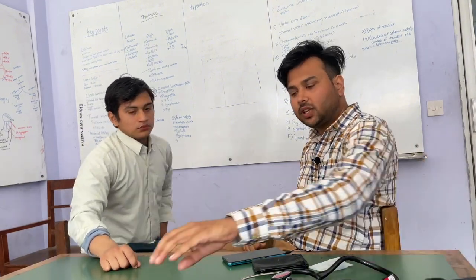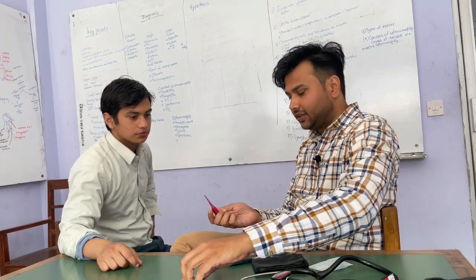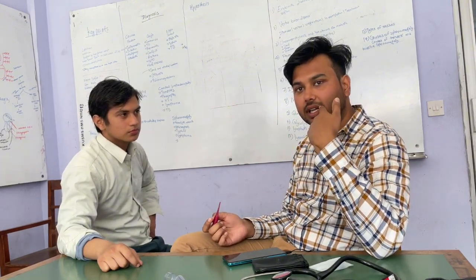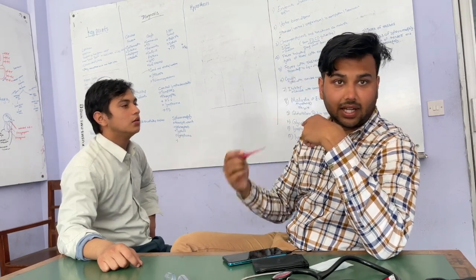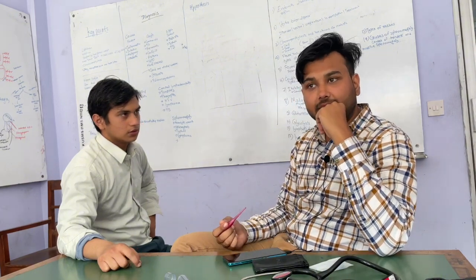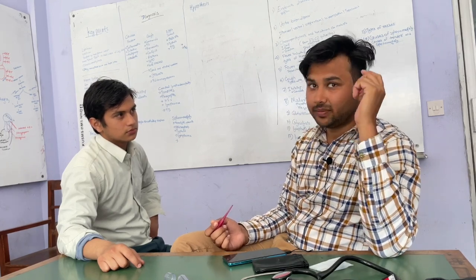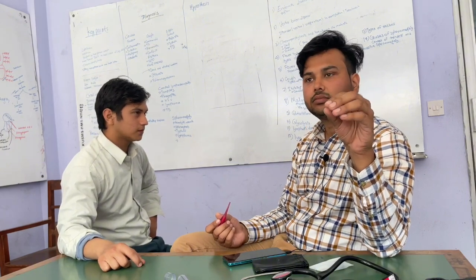Finally, you can also check for temperature. For temperature, what you need is a thermometer. There are four places where you can check temperature. There is the oral temperature, there is the temperature in the ear canal, right? There is the axillary temperature, and there is something called rectal temperature. The most accurate for core temperature is rectal temperature. Okay. There is a debate between rectal temperature and oral temperature, but for now you can say rectal temperature is most accurate for core temperature.